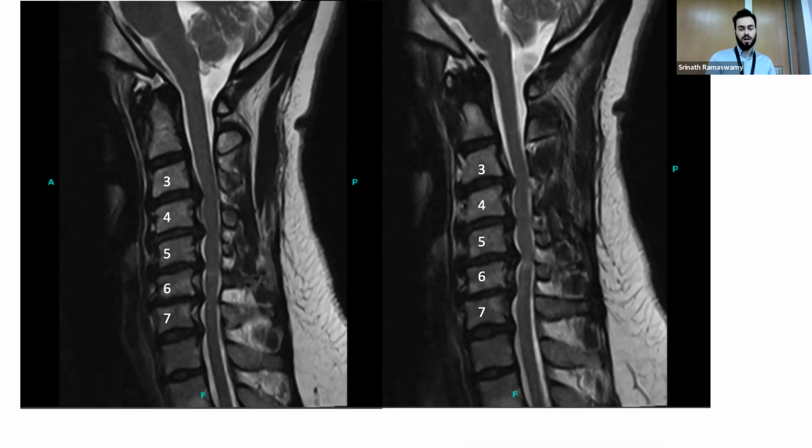If you look at the MRI, she has severe multi-level disease, but what jumps out most is that you can see the spinal cord takes up most of the space in the canal already, and that's congenital stenosis. So it doesn't matter that she's 50 or 5. If someone has a canal that's barely the size of their cord, then the minute a disc bulges, which happens everywhere in the spine, you get a very bad situation. Not because the pathology is different, just because of the location, the worst possible location.